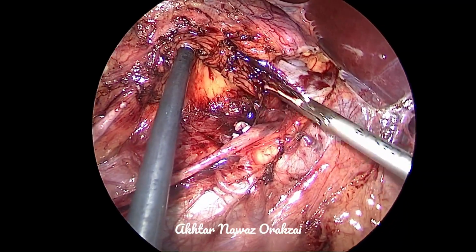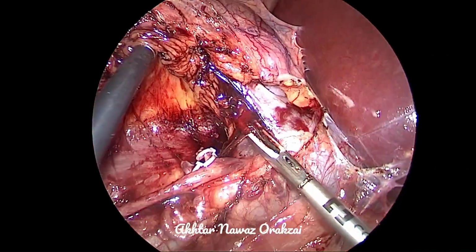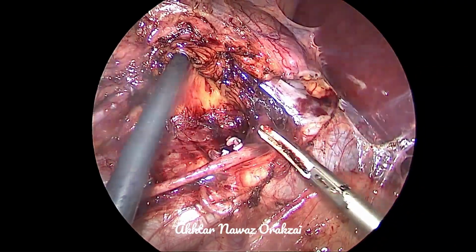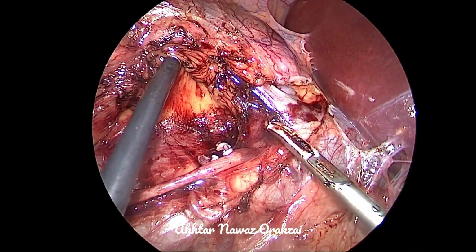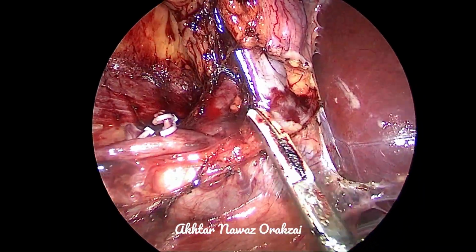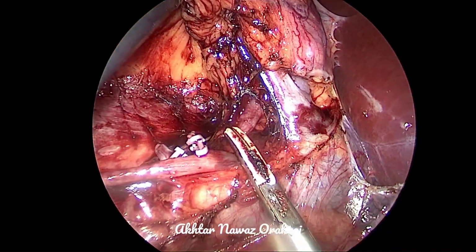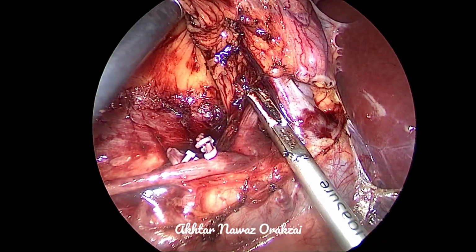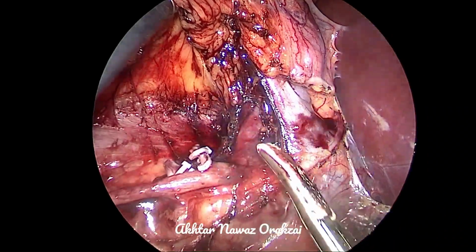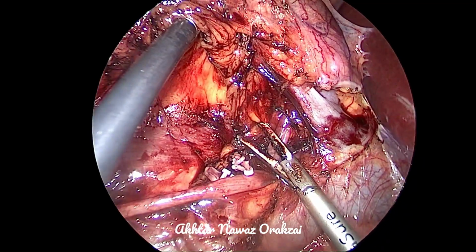So the general rule is to clip the artery first, applying just 1 clip, and dissect the artery enough just to allow 1 clip, so that the blood supply to the kidney is stopped and the vein becomes collapsed, and then we can clip the vein and cut it, and then deal with the rest of the artery. So this is the plan now. So we are trying to find the artery here.